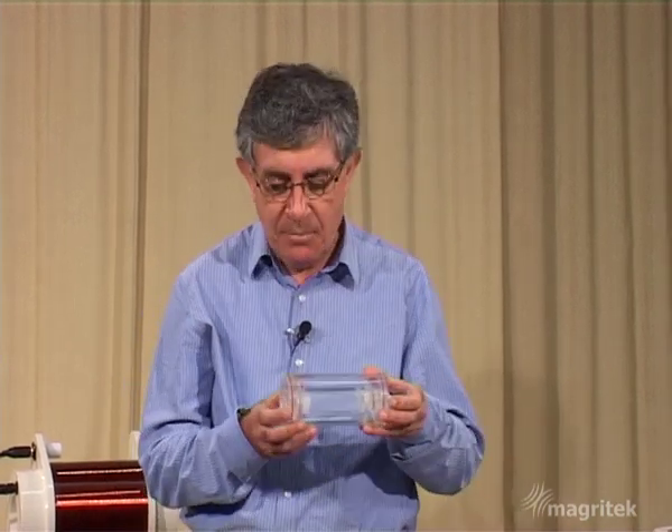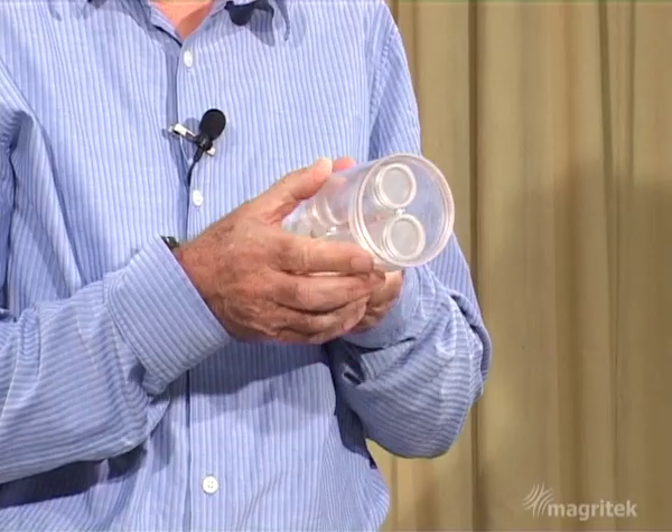In this video we're going to be looking at magnetic resonance imaging and we're going to carry out one of the simplest imaging experiments possible on a very simple sample comprising these two tubes of water.